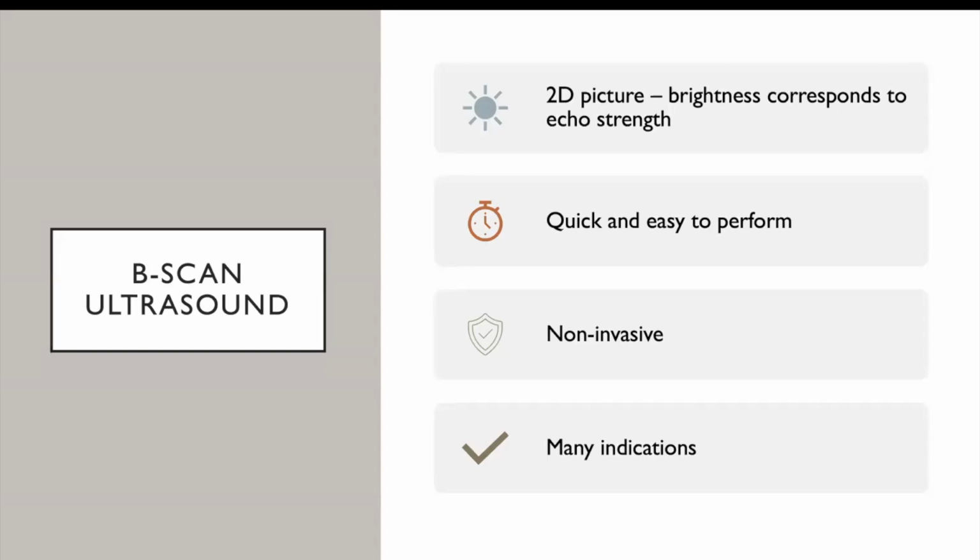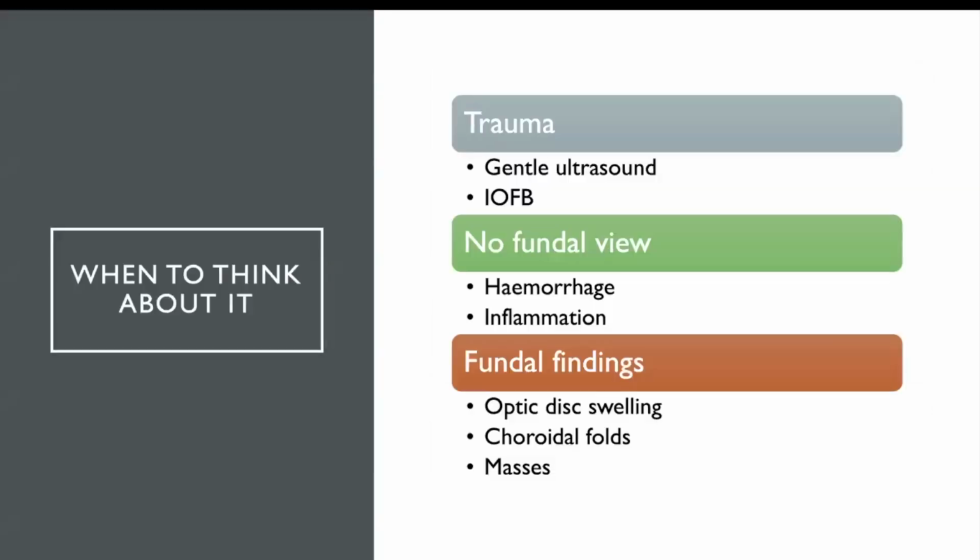It's very quick. It's really easy to perform. It's completely non-invasive. You can just bring an ultrasound in and perform it while the patient is sat there in front of you in clinic. And there's lots of different reasons to do it. So when do you want to start thinking about doing a B scan?